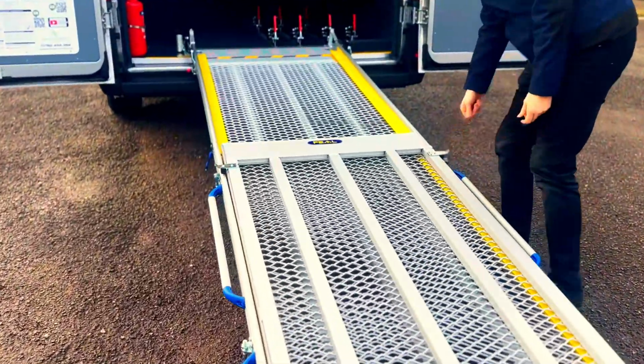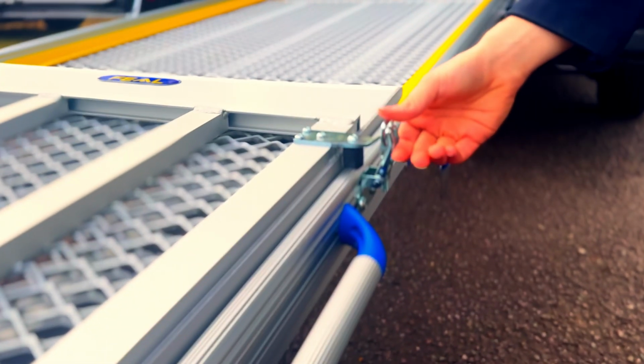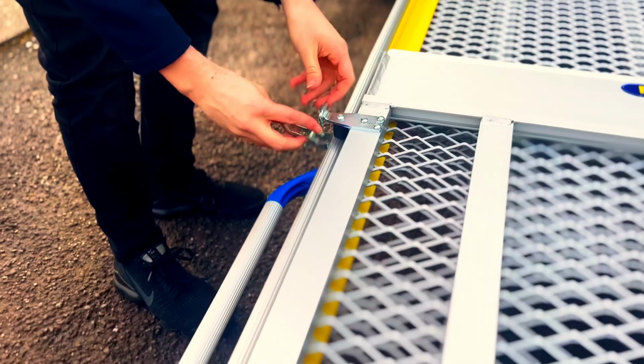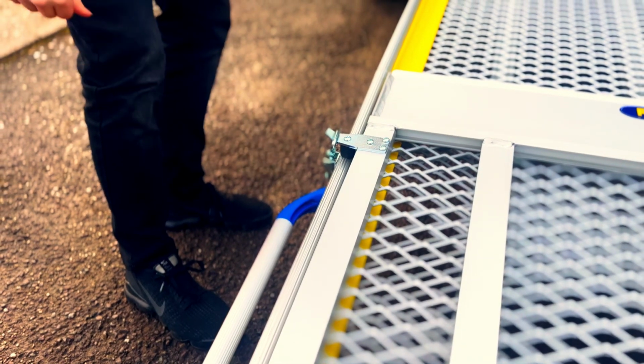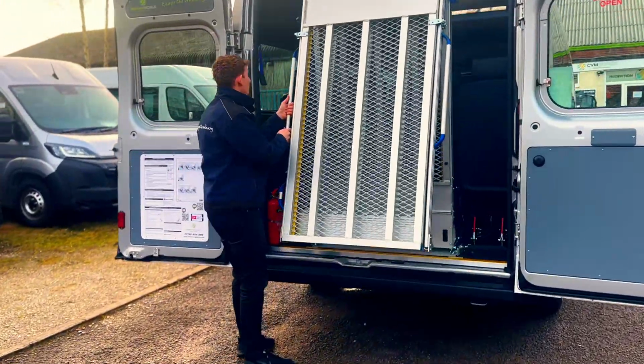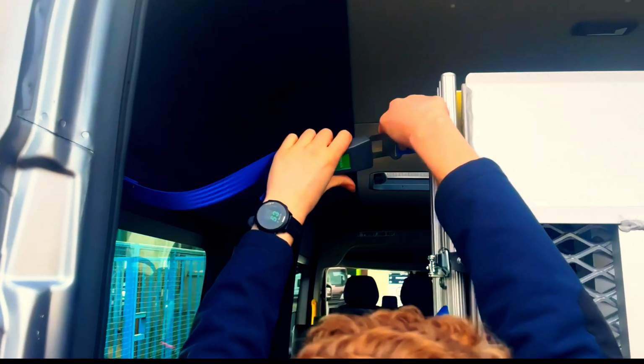Fold the last section up, buckle the clips, fold the main ramp, and finally secure the straps back into place.